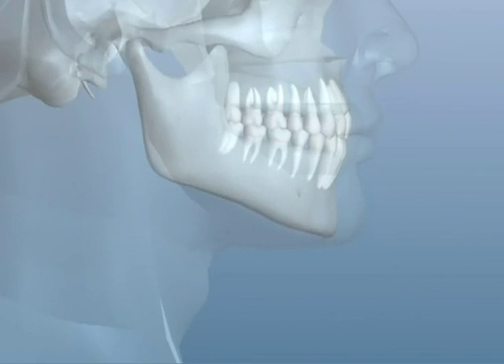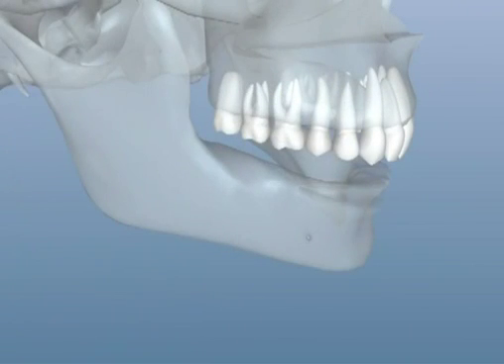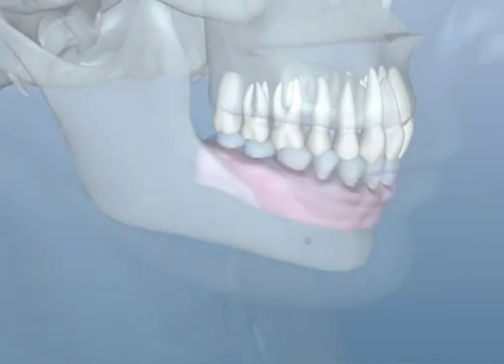Dental implants are most often used in cases where substantial bone loss has occurred, preventing a comfortable denture fit. Now, when teeth and their corresponding roots are lost, the bone that supported the tooth root is no longer needed, so nature allows it to be lost. Over time, this process of bone loss, called resorption, affects the fit of the denture.